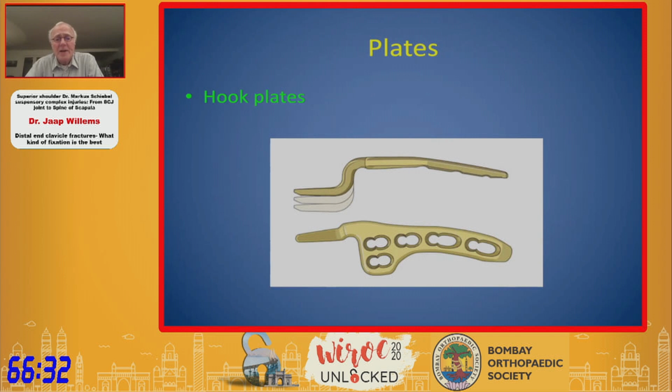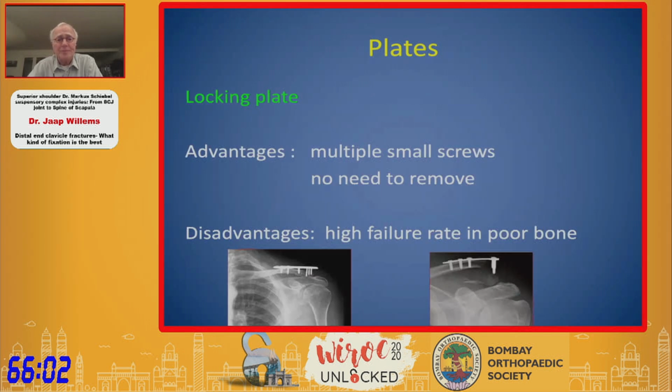Well, the hook plates have been developed, I think originally developed in Germany. There is a difference in step off. It's quite important when you use the hook plate to have a proper step off. If your step off is too small, you can get wear of the acromion. If it is too large, it might compromise the cuff, although it is a little bit more posterior where the cuff is. But nevertheless, you can have problems with a too large step off.